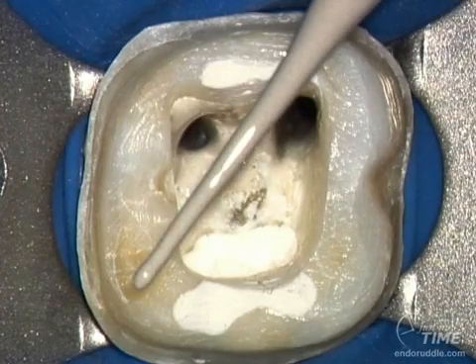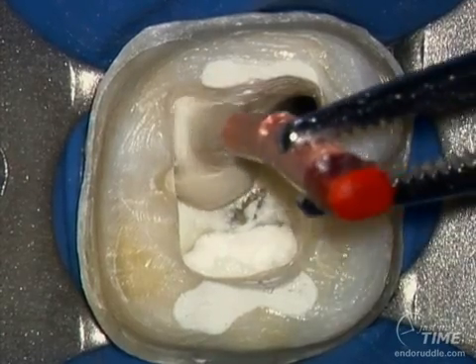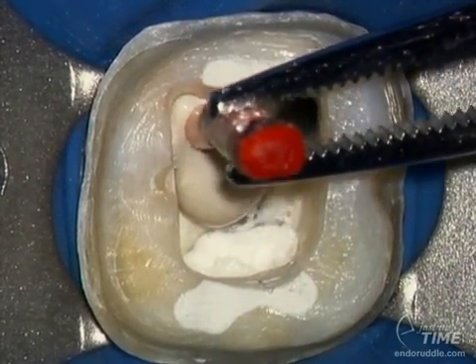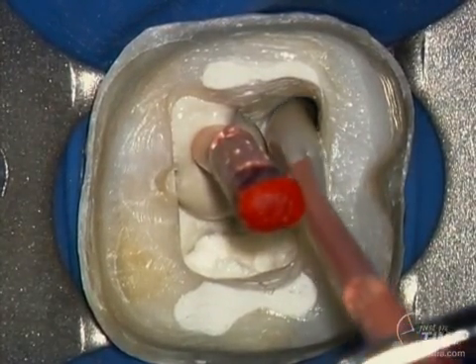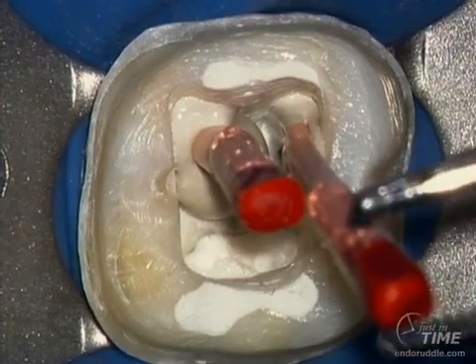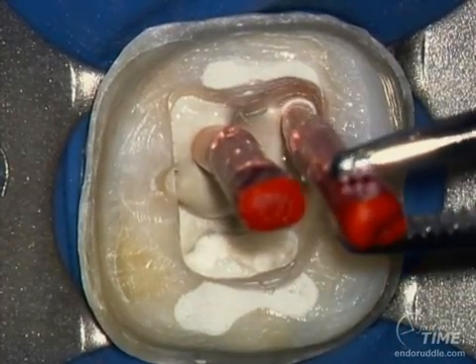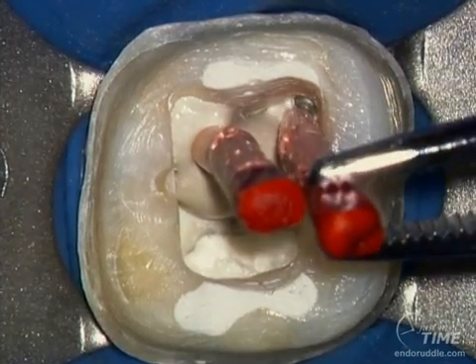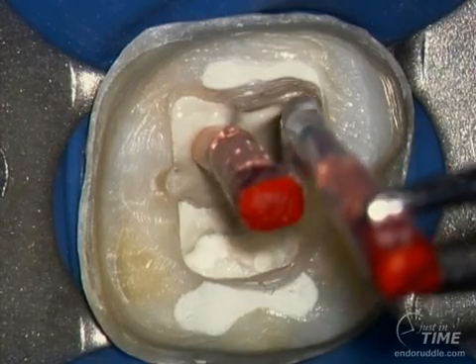Once the cone is seated, remove the cone and inspect it. If the cone is still lubricated with sealer, simply re-tease it back to place. Go slowly so the cement can reflux and move back in a coronal direction. Since we're going to pack the mesial systems together, we would lubricate the MB and tease it to place. By pumping the cone to length or by using a vigorous motion, we can needlessly extrude sealer through the foramen.